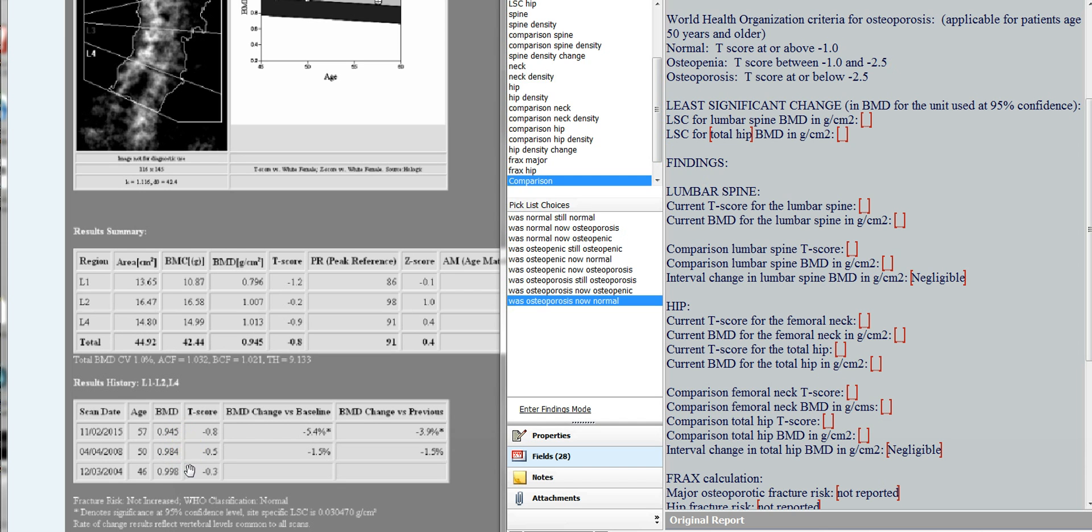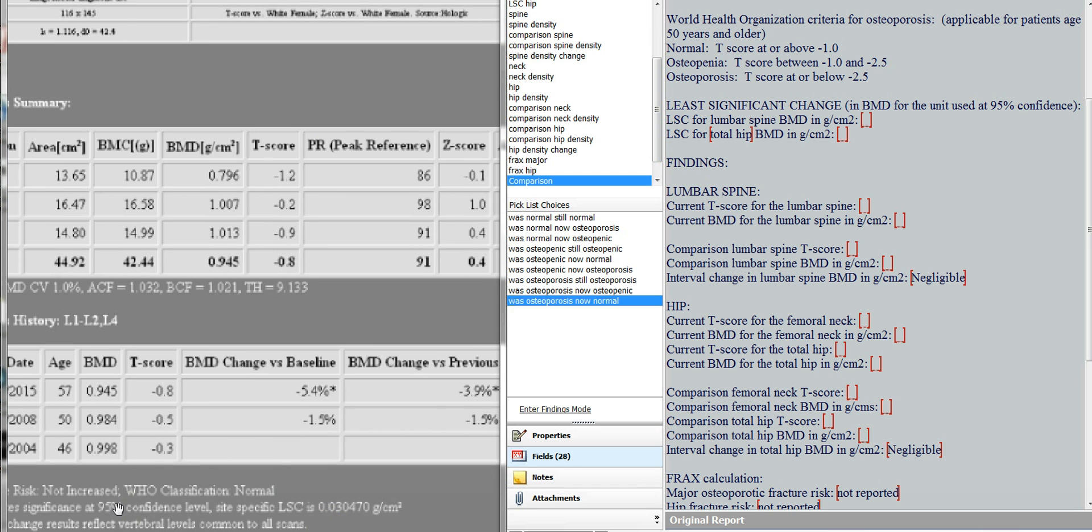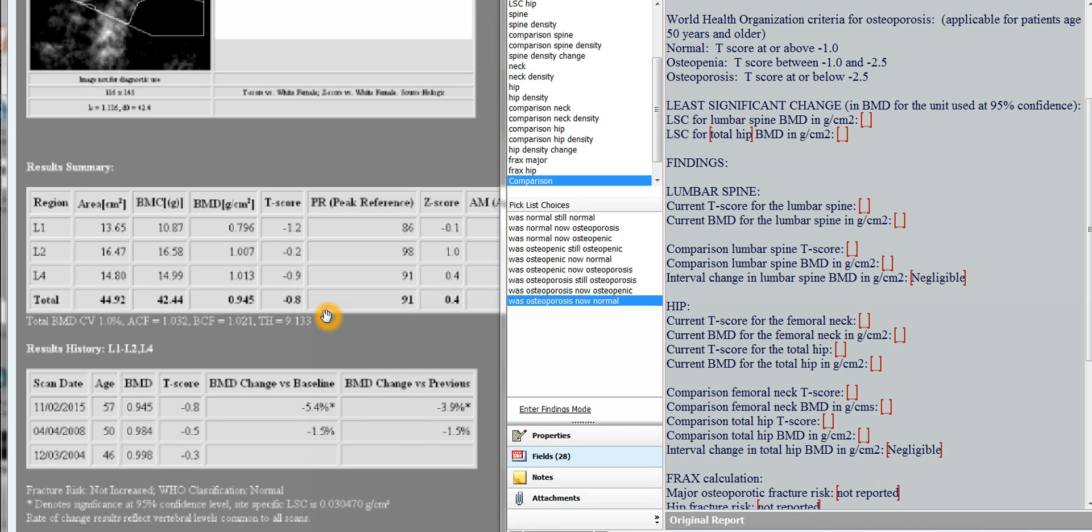And then what you have to do is determine whether this change in bone mineral density is significant. So to do that, you look down here below the table, and this is a little hard to see, but below the table is this least significant change for the spine, and it's reported here at 0.030 in grams per centimeter squared. So for this unit, this is the statistically significant change. So the question is, is this interval change more than required for the statistically significant change? So unfortunately, they tell you the percent change over the interval, 4% decrease, 3.9% decrease over the interval.